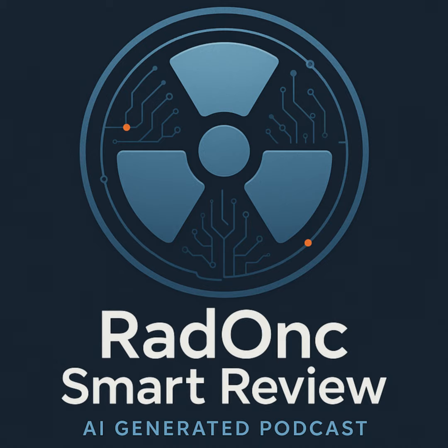The radiobiological hypothesis, or hope, is that by delivering the dose in pulses with significant quiet breaks in between, like that hour off, you allow normal tissues time to repair damage in between each pulse, similar to how they repair during continuous LDR delivery. Trying to get the LDR repair benefit. Exactly. While simultaneously gaining the logistical advantages of HDR remote afterloading, like no manual source handling, no staff exposure during delivery, precise computer control over source positioning and timing.